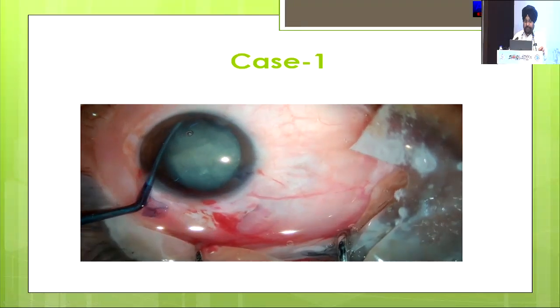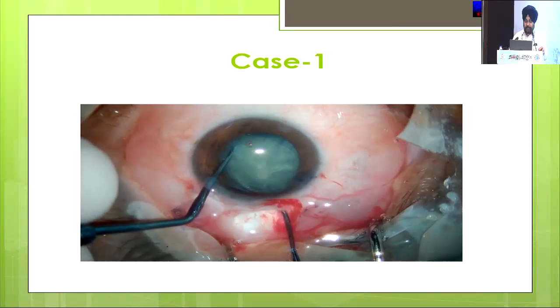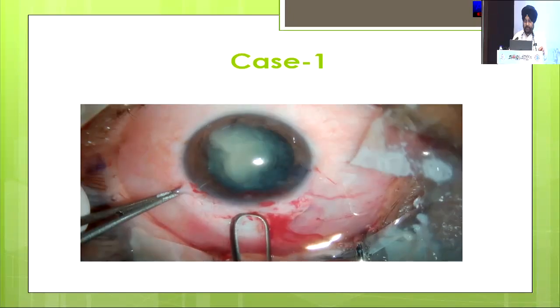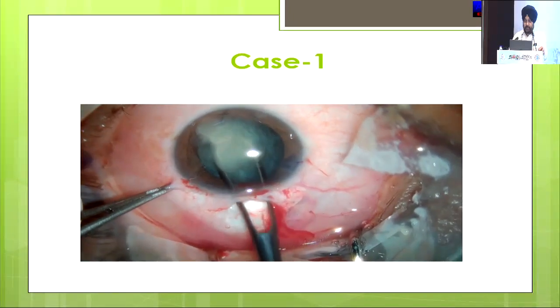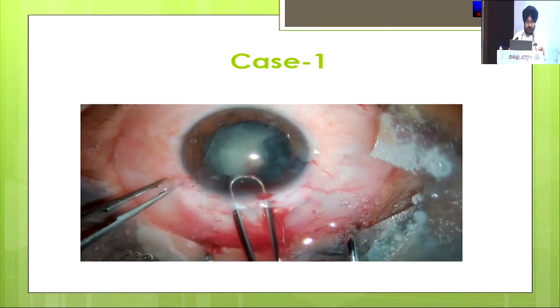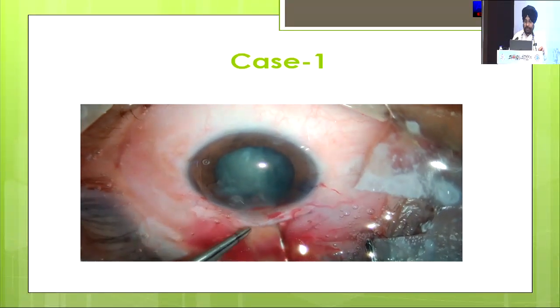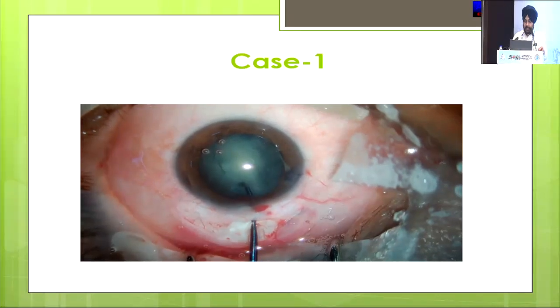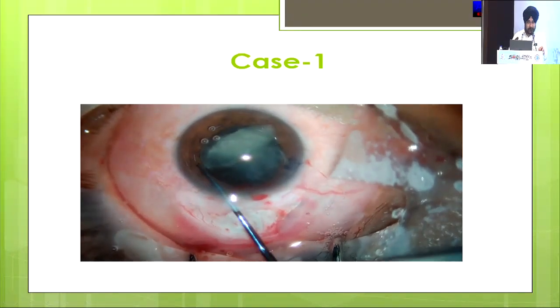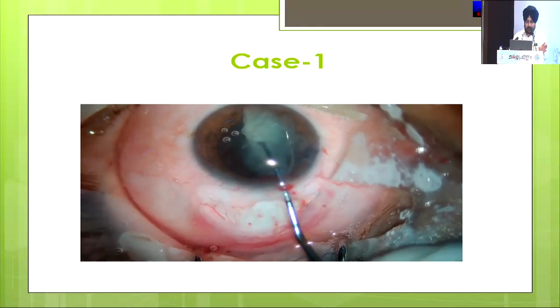This is my way of nucleus fracture, which I learned from Dr. Sahu. With the vectors, you see that there is minimal pressure on the cornea and the scleral tissue. Although we find a little bit of edema near the incision line, that subsides within four to six days.